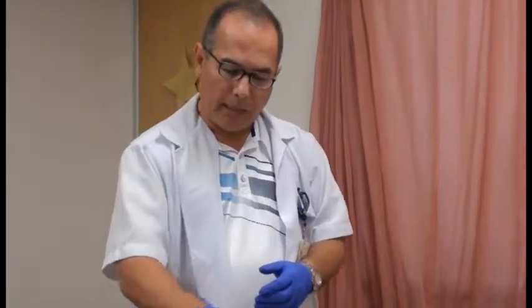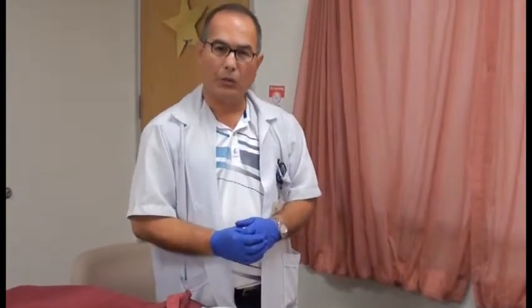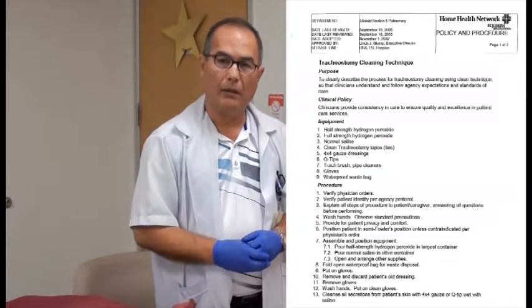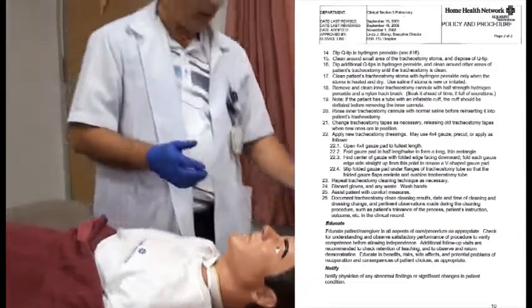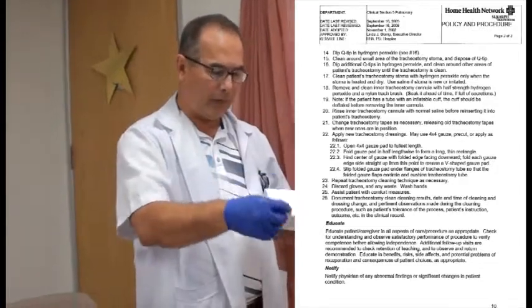A key point here is to never place yourself in front of the patient, because anytime we're manipulating the trach or the inner cannula, that will induce a cough, and that will produce a mucus plug that's going to be flying your way, and you want to avoid that. Again, you can don some protective equipment if you feel that there's a lot of secretions or heavy production of mucus. So the first thing we're going to do is open our tracheostomy cleaning kit here.